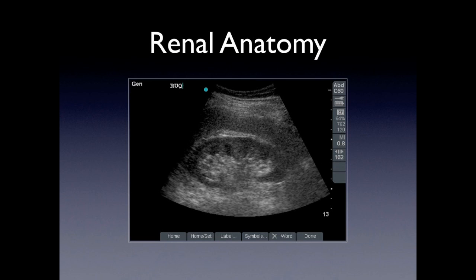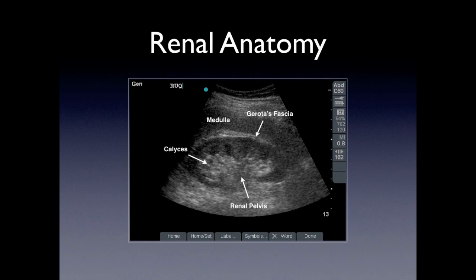As a review of anatomy, we're going to identify the renal pelvis, Gerota's fascia, the renal calyces, along with the medullary pyramids — remember they're hypoechoic — and the renal cortex.